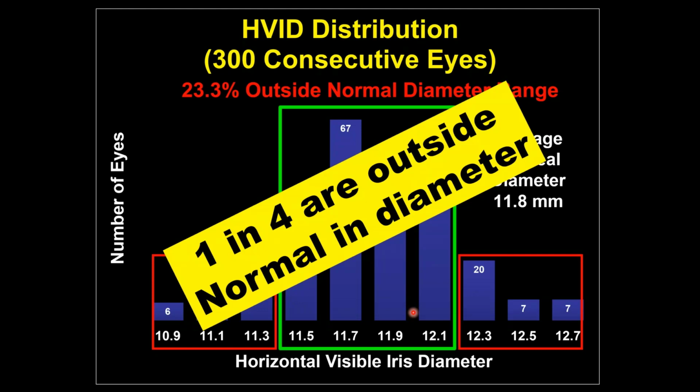So when you think about your specialty contact lens fitting, or even your regular contact lens fitting, how often are you choosing a custom diameter of lens for a patient? Does our lens diameter have anything to do with the significant dropout of soft lens patients that we see every year? Now, of course, we know that dry eye is a huge factor with soft lens dropout, but diameter must factor in there somewhere.